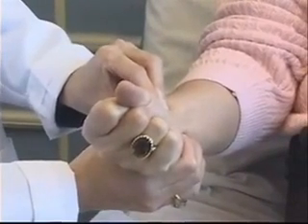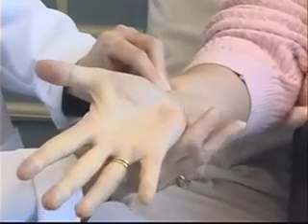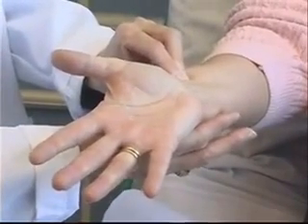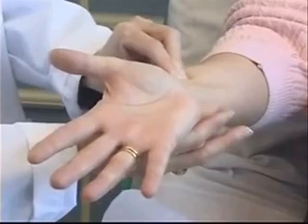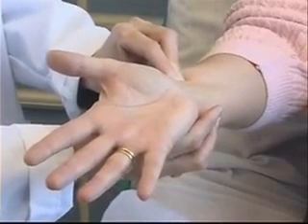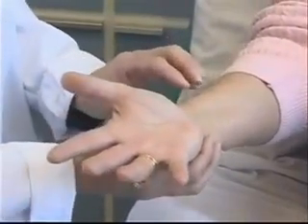After enough time has elapsed, I can ask my patient to please release her fist. I then release my grasp on the ulnar artery and watch for good flow returning to that hand. The hand pinks up again nicely. I now have a positive Allen's test and I am okay to proceed with the procedure.